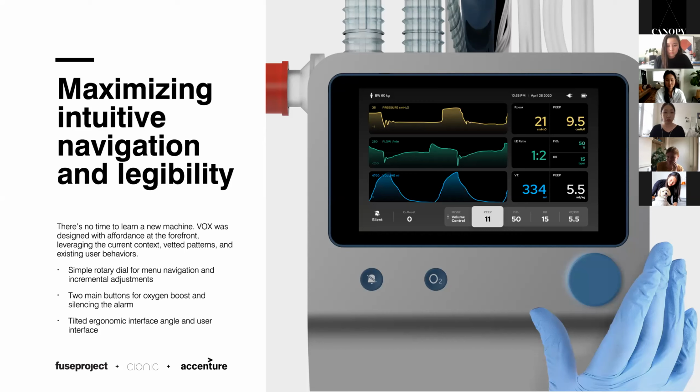So we really wanted to make sure that the interaction elements are still attached to the screen, so that when you're looking at the screen and controlling it, you know which one you're looking at. And even visually, we wanted to separate the elements that are interactable and those that are aesthetic.